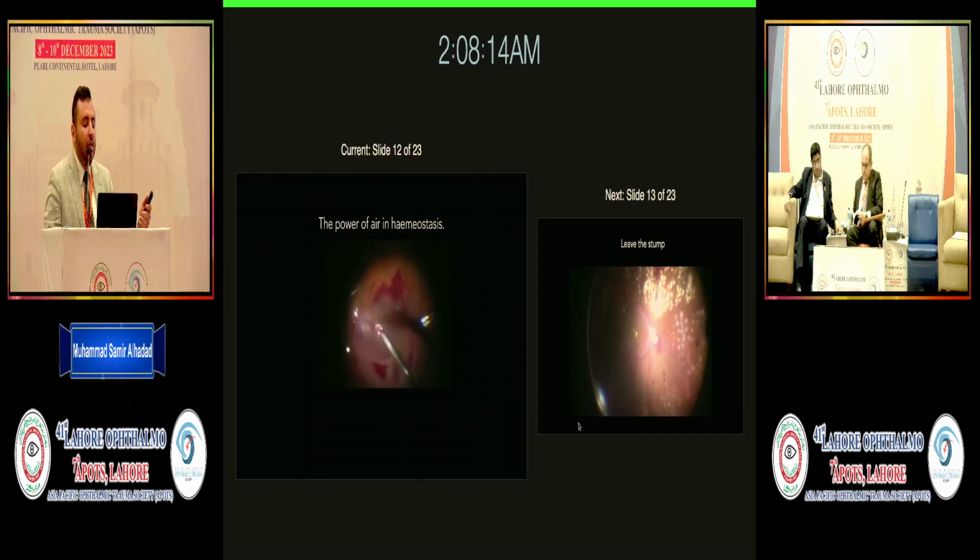And as we see here, this fluid is very tenacious and very thick. It's just like the vitreous. So it's better to be removed by the cutter, and not by suction only, using the cutter duty cycle, which is the core duty cycle.